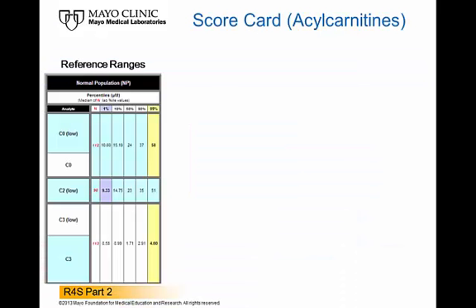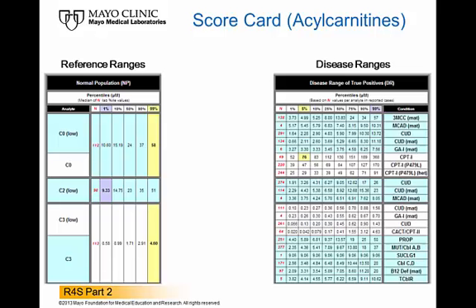The scorecard summarizes in a tabular rather than a graphic way all the data shown as box plots in the previous tools. Each section includes a current count of contributions, either sites or cases, and cumulative percentile values. Reference ranges by analyte on the left side, the high and low disease ranges on the right side.